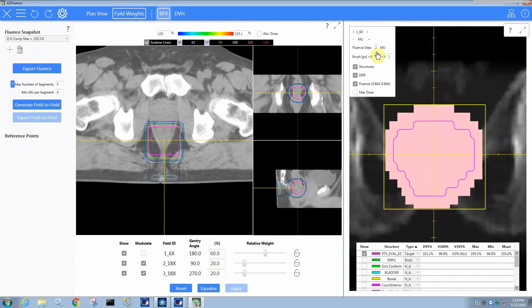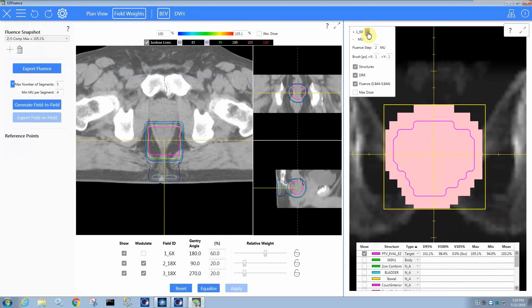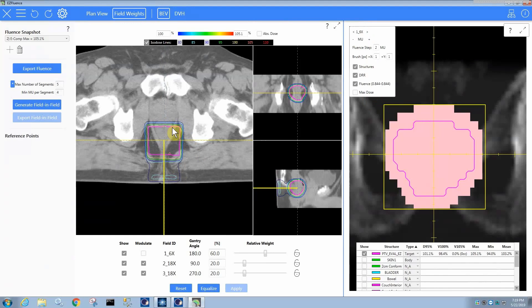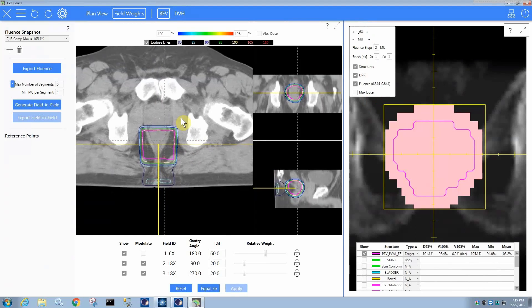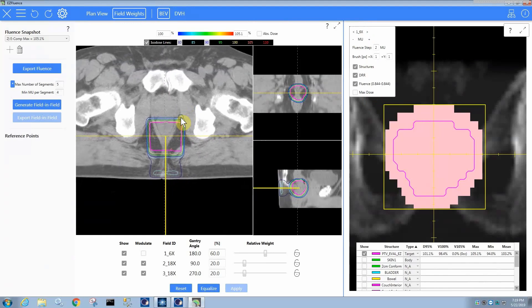When I go to the beam's eye view tab, you can also see there's a plan view and a field weights tab. We're going to get to those in a minute. But the beam's eye view tab works as it does for the breast plans. You can see here my first field, the PA field, which is highlighted over here. This field, this view, you can use the mouse wheel to click and drag in order to move around.